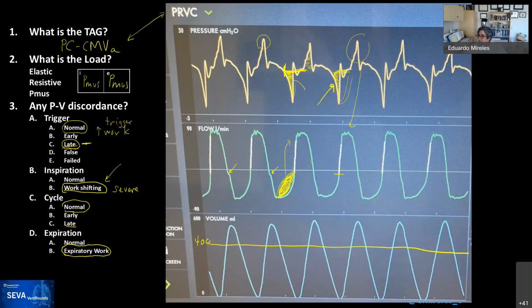Oh, okay. So we're starting to get some other comments. So alrighty, the question is what to do for these patients. I have a couple of comments. There's one from Aman, who tells us that he would like to do a reasonable amount of pressure support. On the other side, we have Hara telling us, well, I would do pressure support or paralyzing.